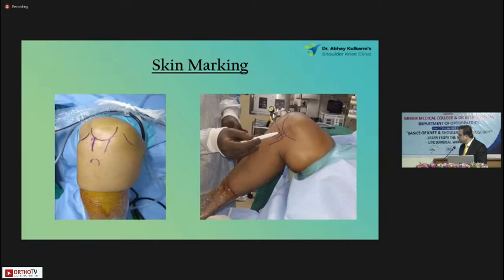I've marked the patella, the patella tendon, both the condyles, and the tibial tuberosity. On the medial aspect, there's a femoral condyle, a tibial condyle, and the MCL. Marking the MCL is very important whenever you are starting your knee arthroscopy.